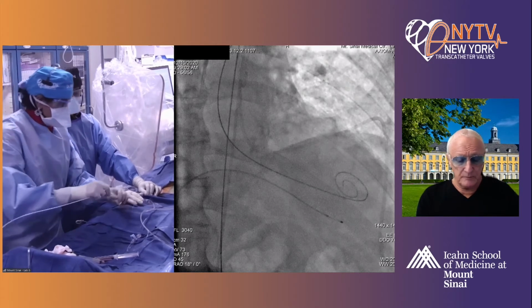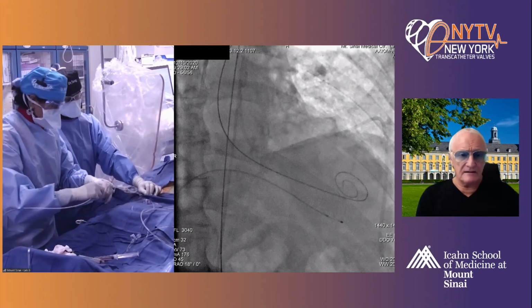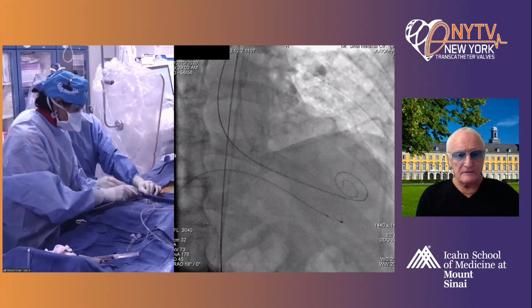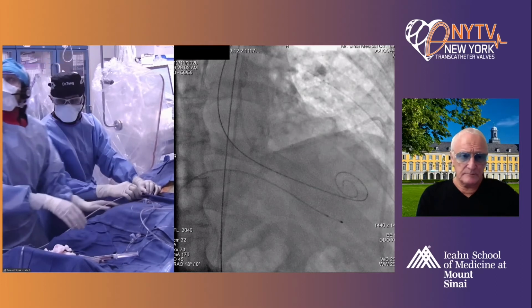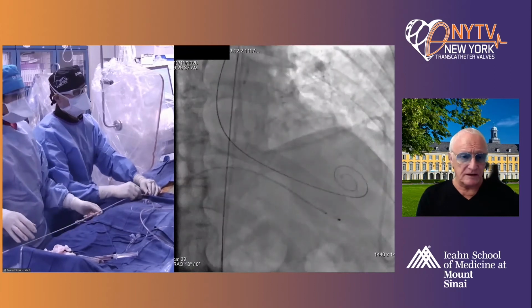I would not dilate in order to make the sealing a little bit better. And I think the choice of neuroprotection is excellent here. In bicuspids, this belongs to the risk factors for embolic protection.